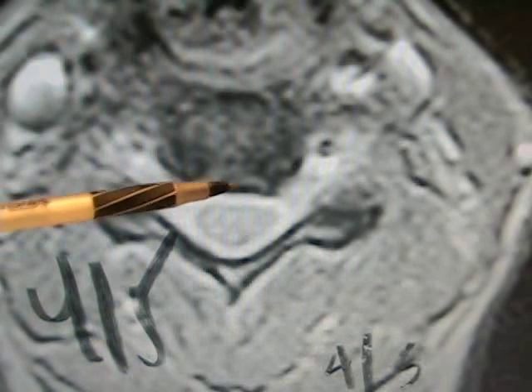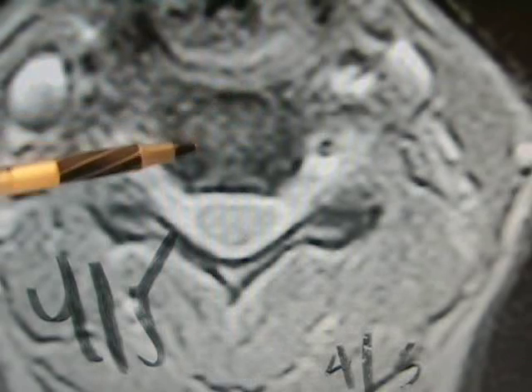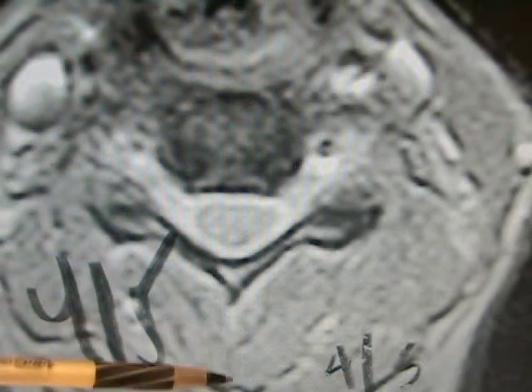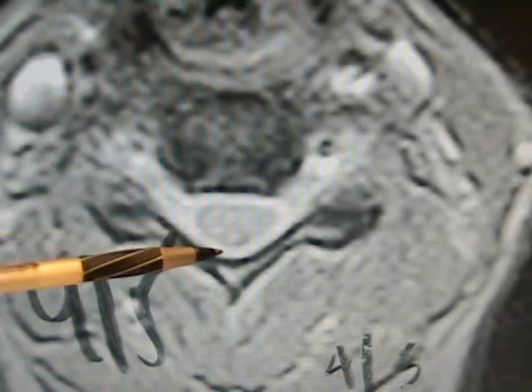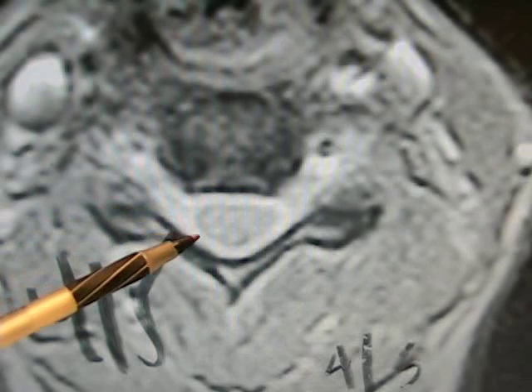This is a normal axial view of the cervical spine, and this is designated between the C4-5 level, as the marking indicates here, and this is a view with the bone or vertebral body or disc in front. So this is the anterior vertebral body, posterior back part of the spine. This gray thing in here is the spinal cord, and then again the white around it is spinal fluid that surrounds the spinal cord. What we see here is the hole where the nerve exits, which is called the foramen, and the foramen is normal on both sides of this image.